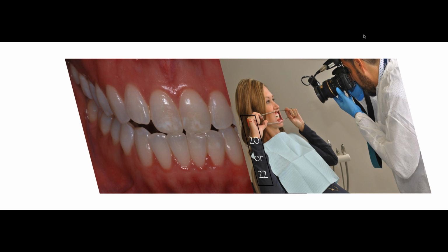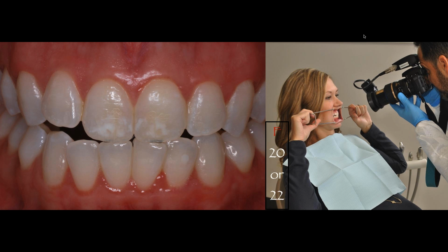So now you can see I have edge to edge. I still have a very good field of view. I'm viewing the buccal surfaces of canines, bicuspids, and the first molar. And I'm using the exact same f-stop, and you can see the distance that I am from my subject at this point. Same f-stop, but what did I do? Now I made my field of view a little bit narrower, meaning that I came closer to my subject. Now you can see that we cannot see molars. We can only see up to the first bicuspid, then the canines, laterals, and centrals. The same technique: the patient retracts, we dry, and then we take the photo.